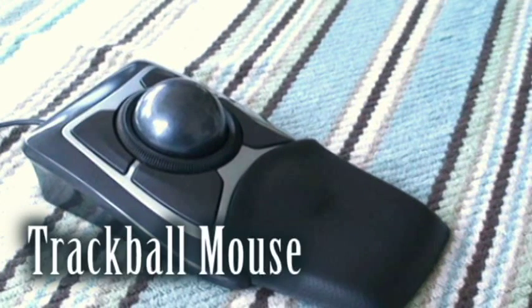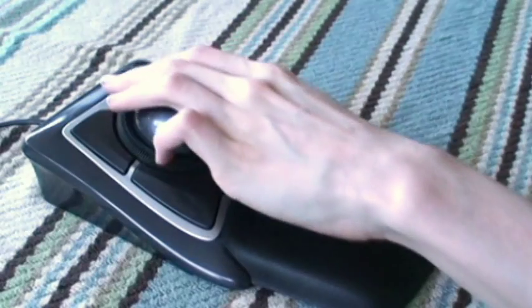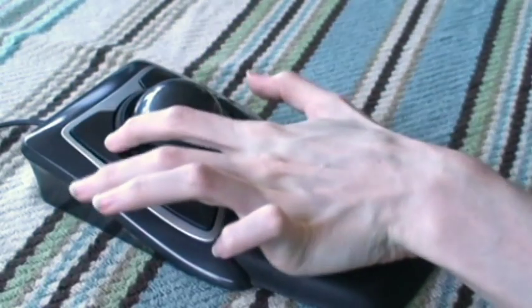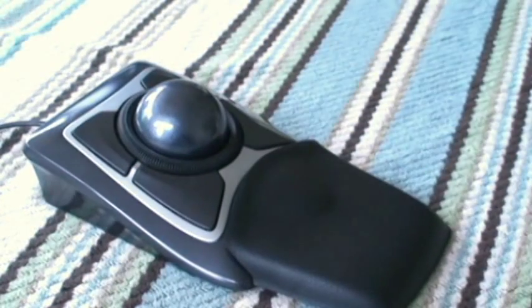If it's hard for you to grip things, the trackball allows you to roll the mouse instead of move it. You can program these side buttons to drag and drop, double click, single click, right click, open a program, or do nothing at all — all with one touch.